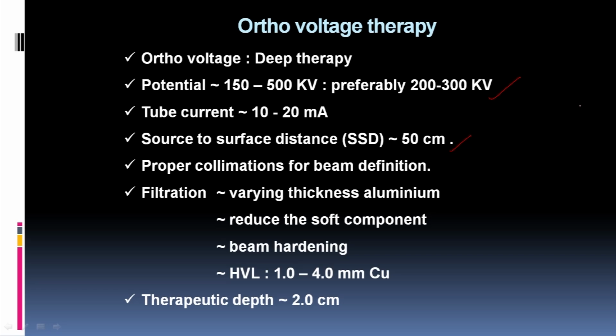50 centimeter from the source. We will discuss in later classes how this increase of source to surface distance is helpful in achieving better penetration or better depth dose distribution.